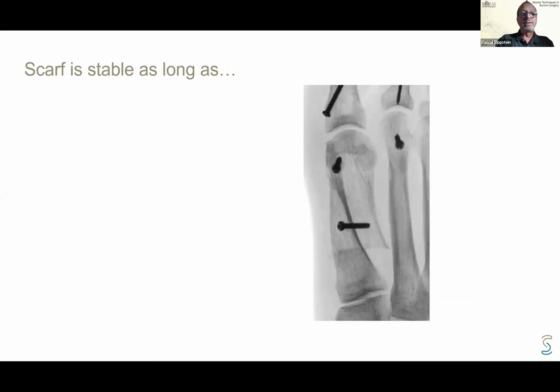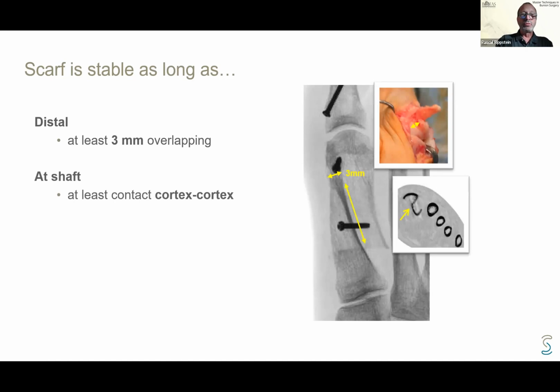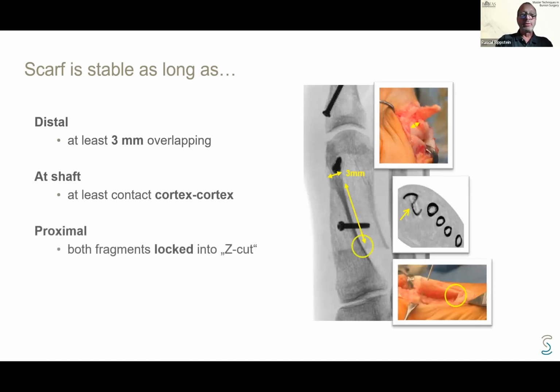And I realized that actually with a scarf, you can get a stable scarf when you have what I call the 3 point of fixation. And actually, there are 3 points which are fixating the distal fragment. The distal one is an overlapping of both fragments, which should be at least 3 millimeters. At the shaft, you should have at least a contact between cortex and cortex. And proximal, both your fragments should be locked into the Z-cut, which is also a stabilizing structure.